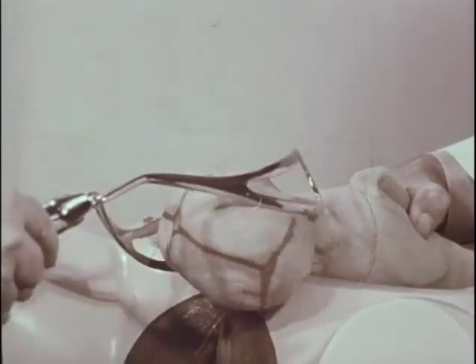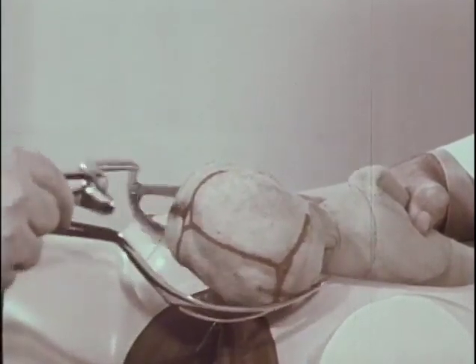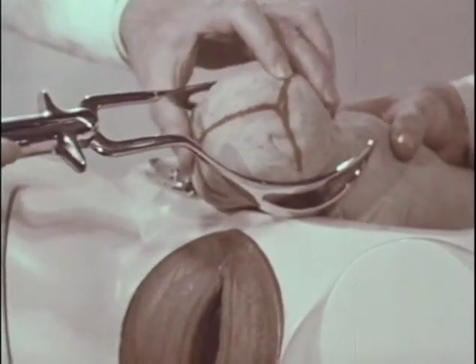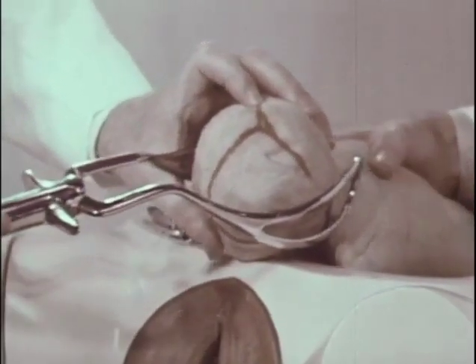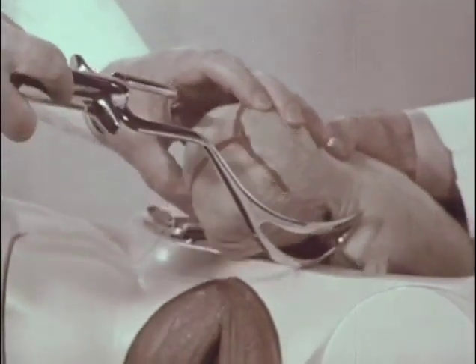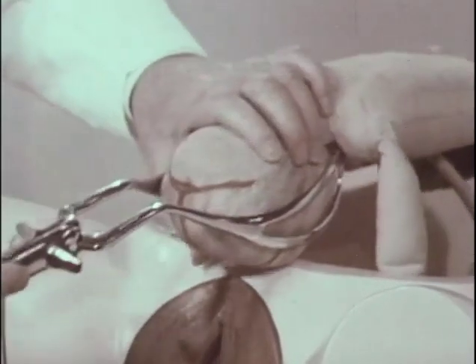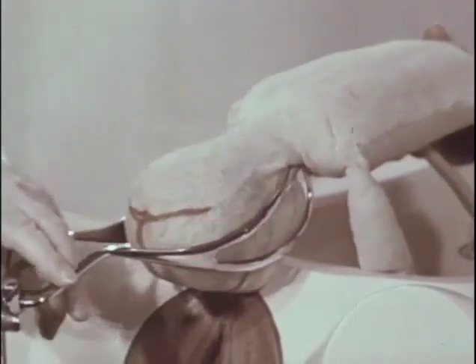Then the forceps have to be carried around to the opposite brow mastoid position. Then with the next readjustment, it's a partial brow mastoid. Push up, rotate, just a small arc, pull down. And eventually, with readjustment, the blades tend to coincide with the cephalic curve. Push up, rotate, pull down, and we have the biparietal bimalar application and proceed with traction.